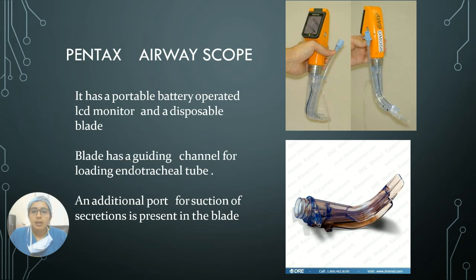Pentax Airway Scope. It has a portable battery-operated LCD monitor and a disposable blade. Blade has a guiding channel for loading the endotracheal tube. An additional port for suction of secretions is present in the blade.